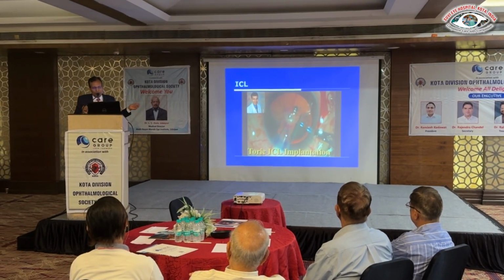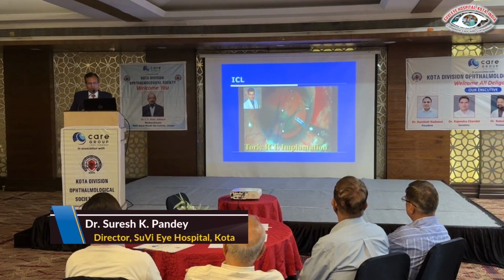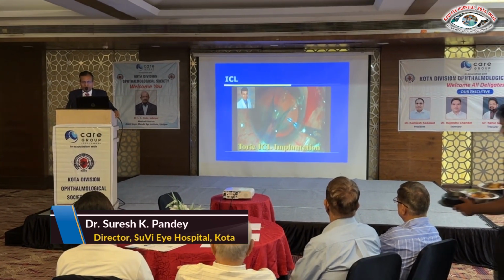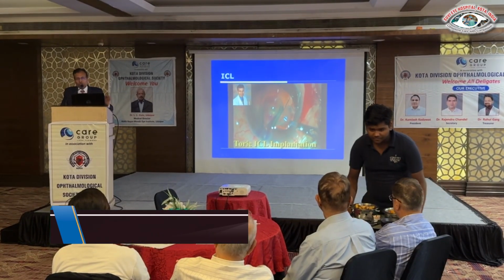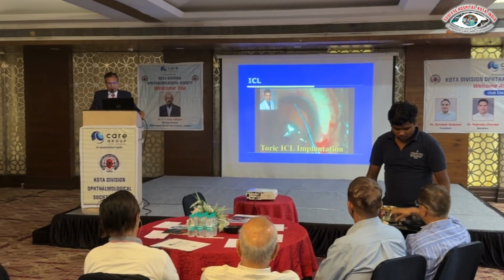In this case, I am implanting the Toric ICL, and you can see the lens is being implanted using a 3.2 mm incision. You can use a 2.8 mm incision to implant the Phakic lens from KDOS India.